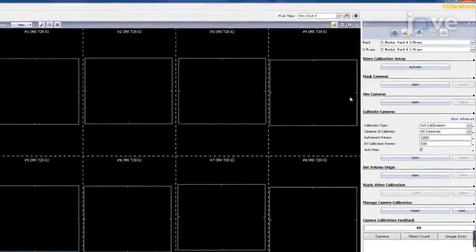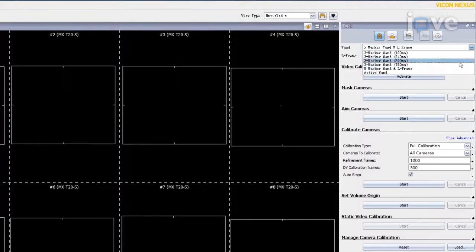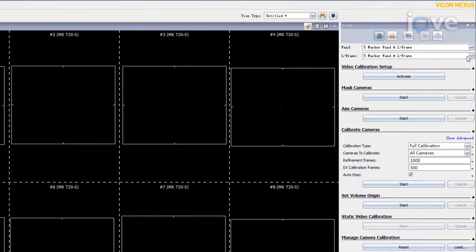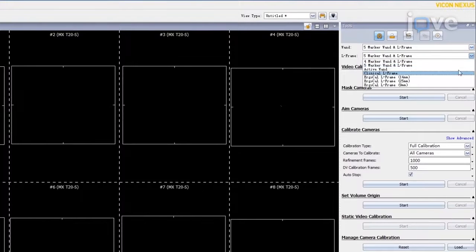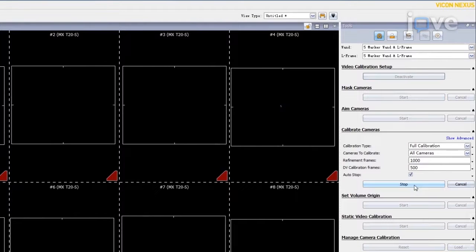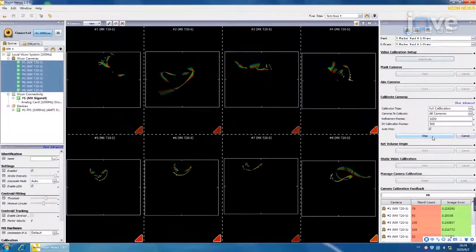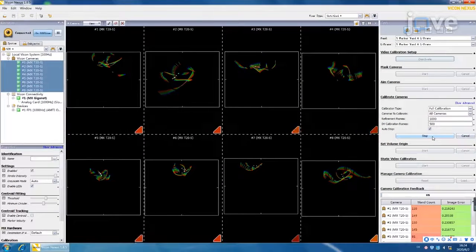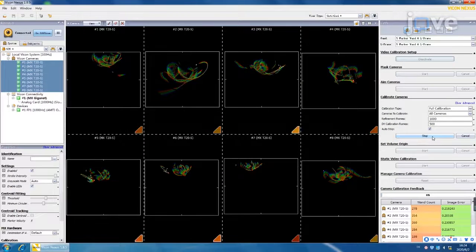In the T-frame drop-down list, select the 5-marker wand and T-frame calibration object. In the System Preparation Tools pane, click the Start buttons in the Mask Cameras and Calibrate MX Camera sections. When the calibration process is completed, the progress bar will be restored to 0%.